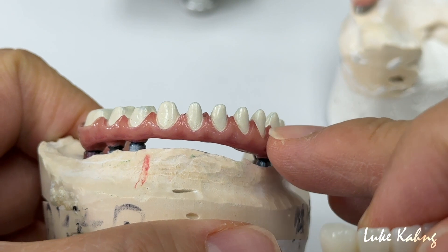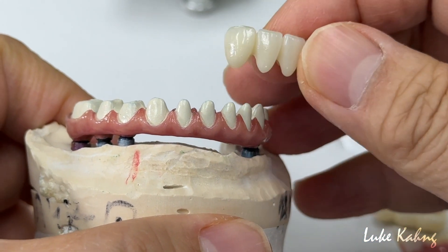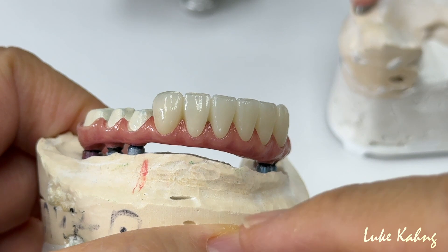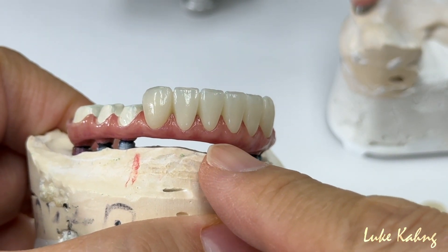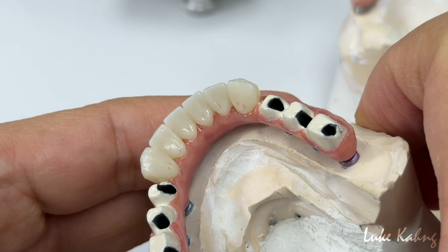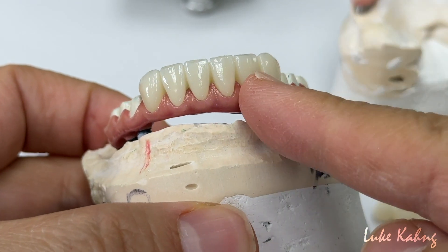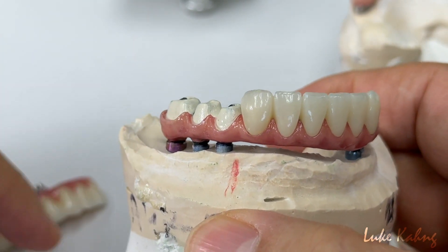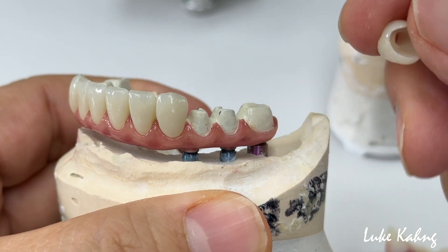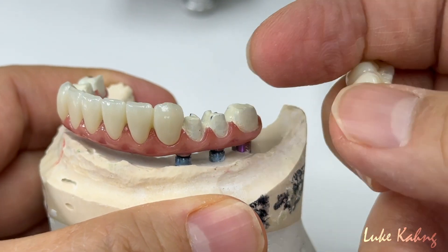A lot of technicians use composite because it's much easier to build up, but ceramic is tougher and more resistant. It can stain and everything, but it stays well. After cementation, tensile strength is way higher, so you're hardly going to break or chip it. This one will be fabricated over zirconia.